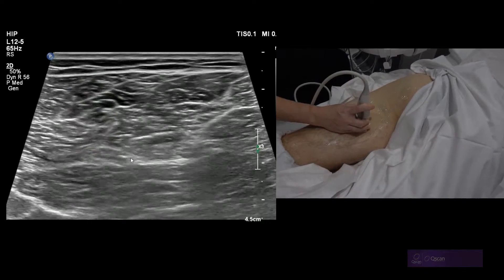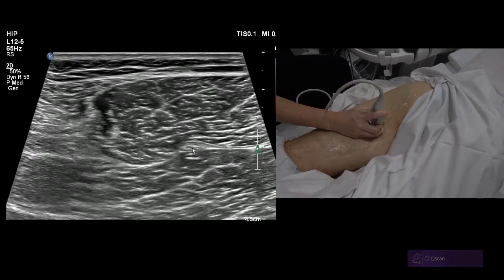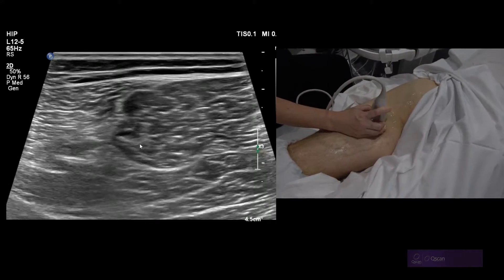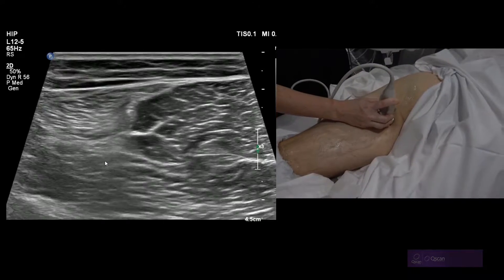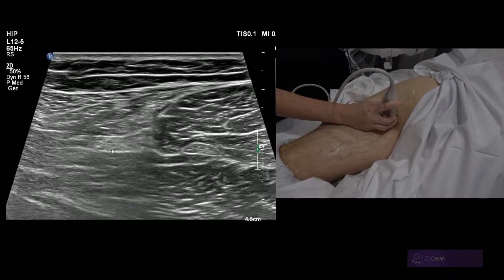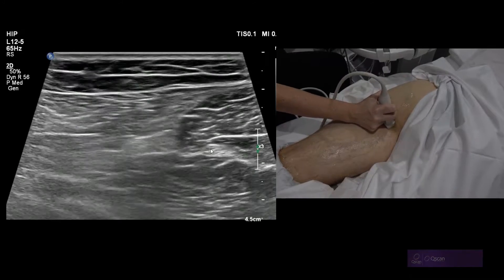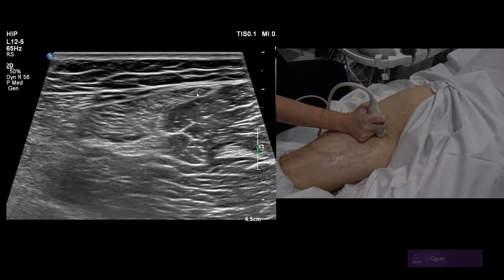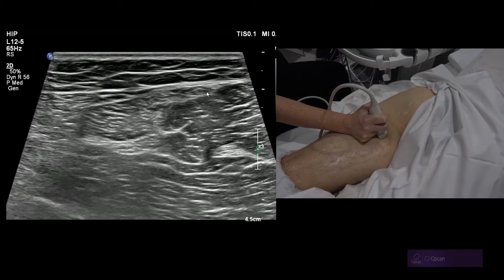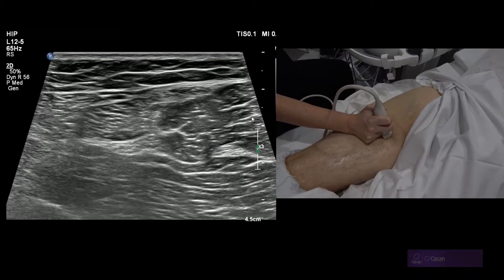Going a little higher, there's the semi-membranosis, and higher still, there's the semi-membranosis tendon. You can see how it's very close to the sciatic nerve, so you could get the two mixed up. As you go up, the sciatic nerve is more lateral and the semi-membranosis is more medial. This white fascia here is the conjoint tendon — it's kind of an S-shape, and that's the merge point between your lateral hamstring and the semi-tend.